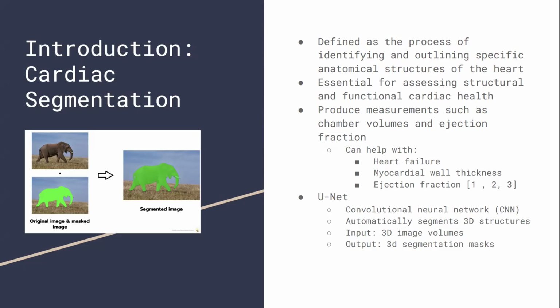It is essential for assessing structural and functional cardiac health, and it can produce measurements as its outputs, such as chamber volumes and ejection fraction.